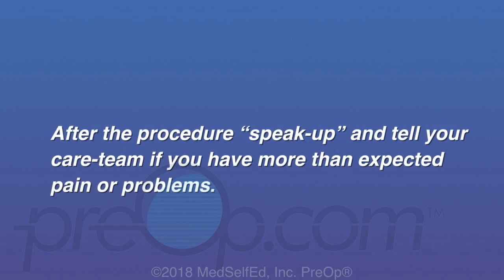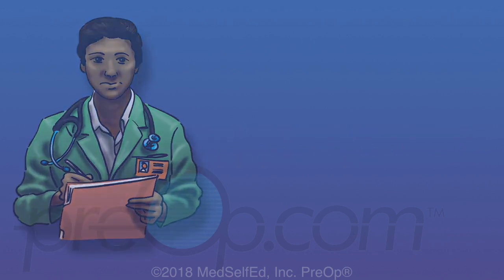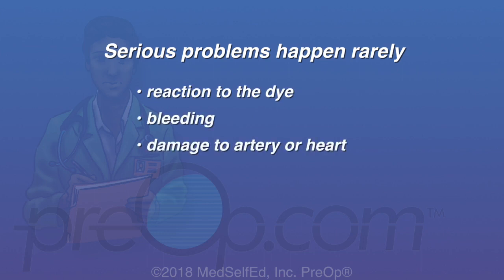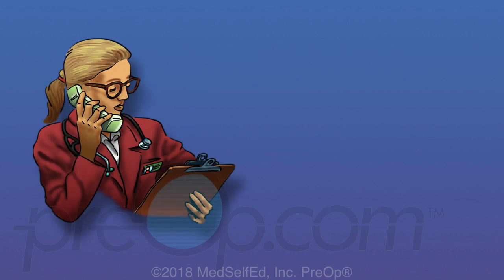After the procedure, speak up and tell your care team if you have more than expected pain or problems. This is a common, minimally invasive procedure. Serious problems can happen, but rarely. There is a risk of having a reaction to the dye, bleeding, damage to an artery or the heart, stroke, heart attack, and even death. That is why you are monitored closely during and after the procedure. You can help by telling the staff about any problems you are having.